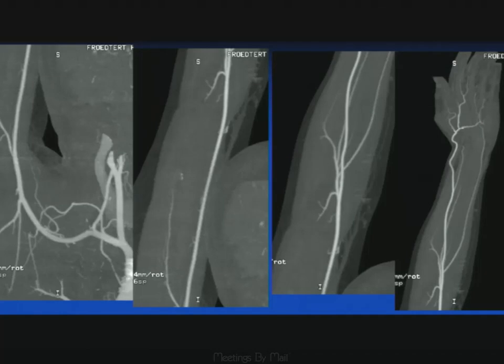So here's the anatomy, and obviously we image the upper extremity from really its innominate origin here on the right side, down through the elbow, and from the elbow down to the wrist, and from the wrist into the palmar arches, and the palmar arches to the common and then proper digital vessels. It's easy to do that in people who are young adults who have good circulation. People who are older and have slower circulation, it's harder to actually image those vessels distal to the palmar arch.